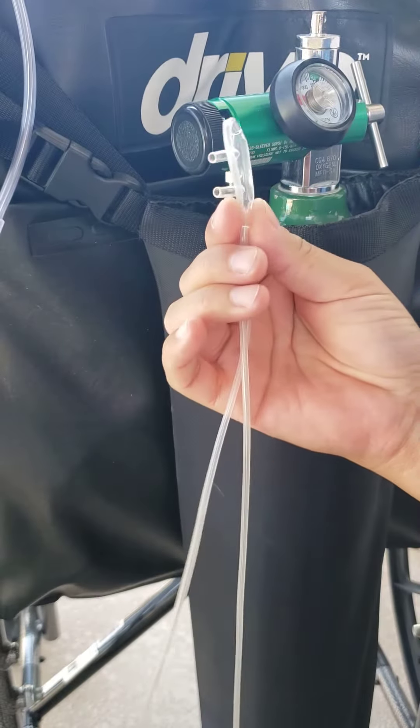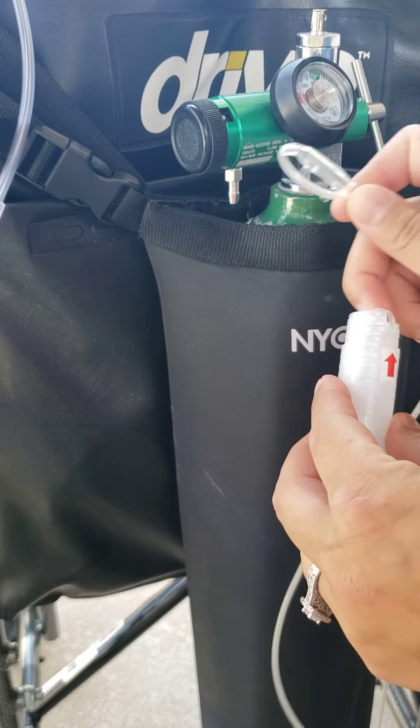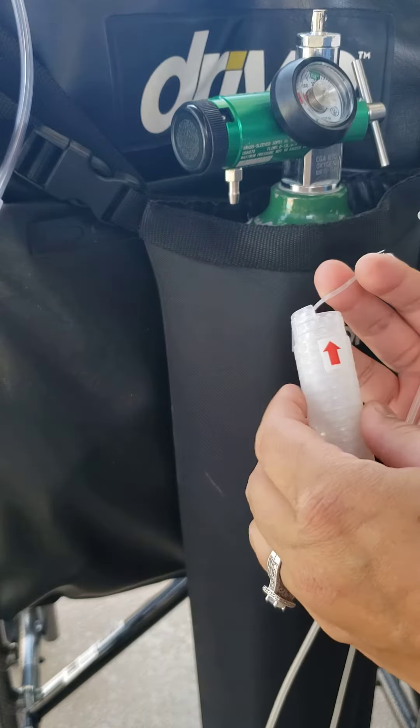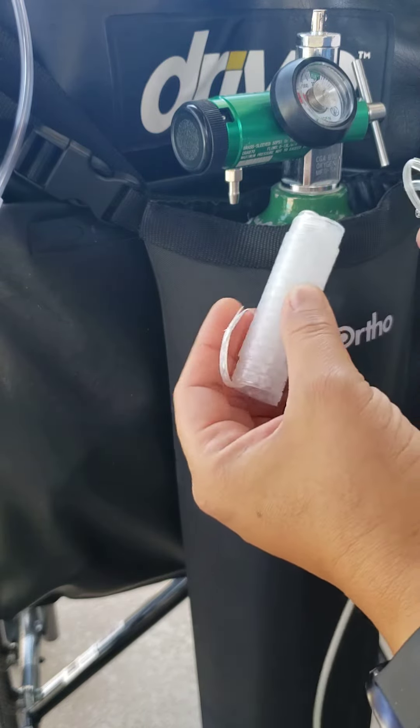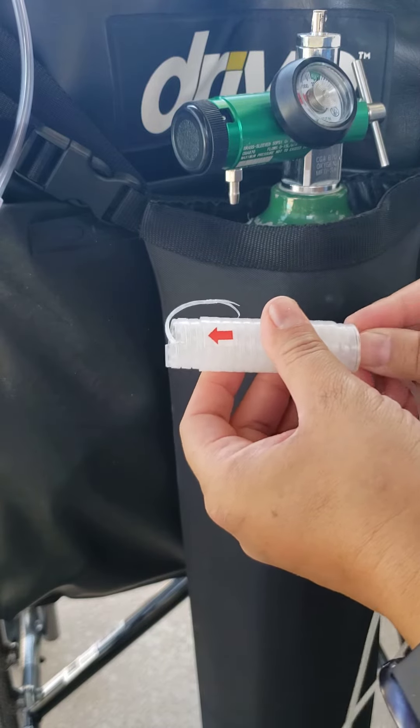What we're gonna do is we're gonna thread the cannula. We're gonna take out the tail on the end of where the arrow indicates, flip the kink clear over, and you're gonna just go ahead and thread your cannula through.